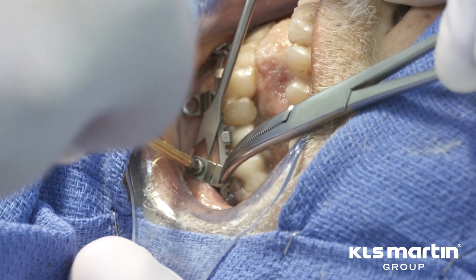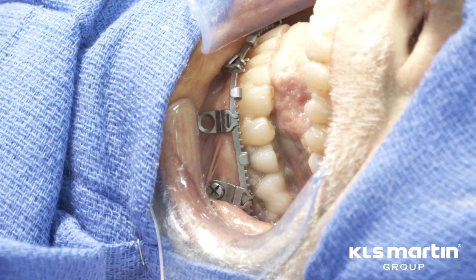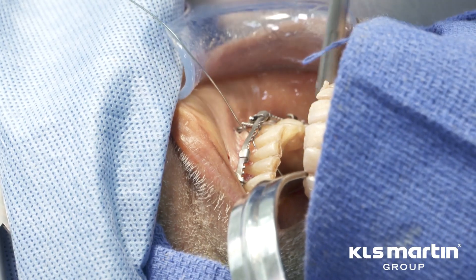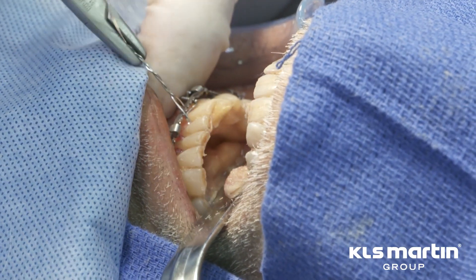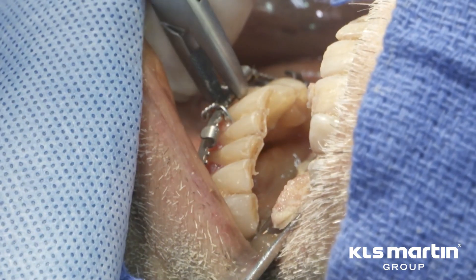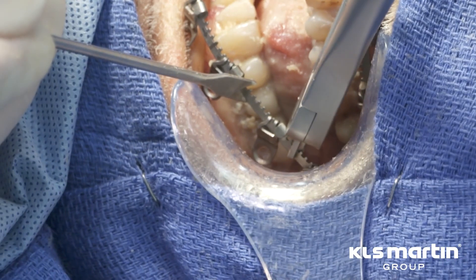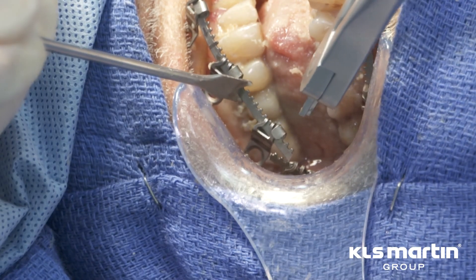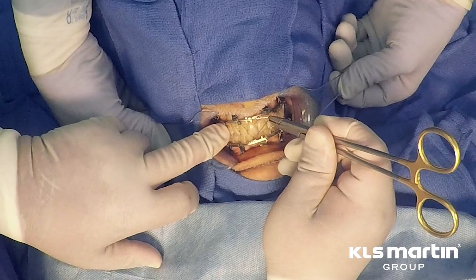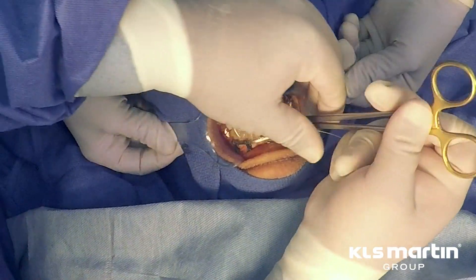As shown here, placement height of the arch bar in relation to the dentition is the same as with a traditional tooth-borne arch bar. If a dentoalveolar fracture requires further stabilization where bone plates are not well suited, a wire may be passed around the L1 MMF arch plate and teeth as with a traditional tooth-borne arch bar. Unused slider plates or segments of the arch plate may be removed in situ using the L1 MMF cutter. After securing each slider plate, perform wire closure in the same manner as with a traditional tooth-borne arch bar.